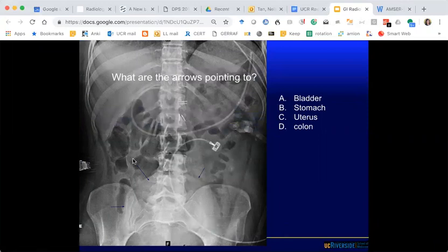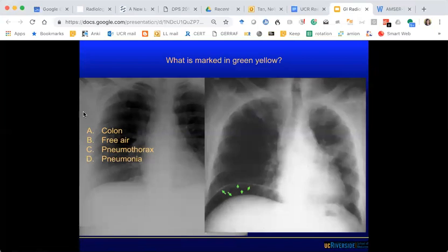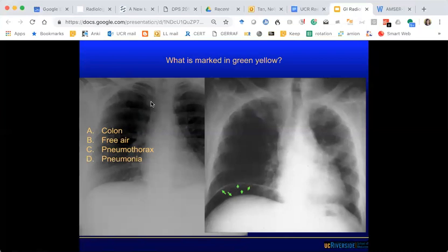What is marked by the green arrow on the right, compared to the normal image on the left? Free air — great. And what is this radiopaque catheter here? It's a PICC line — good. And is it in the right place? Yes. The PICC line should be in the central region around the SVC. If it's up by the brachiocephalic, that's too proximal, because injecting chemotherapy can sclerose veins if the caliber is not large enough — you need high flow. If it's too deep in the right atrium, it can cause arrhythmias because it'll flop around.